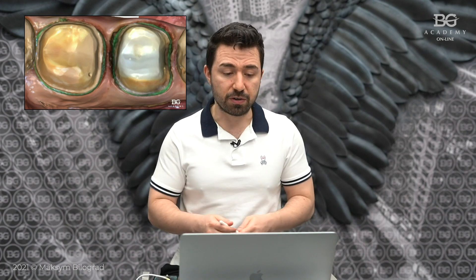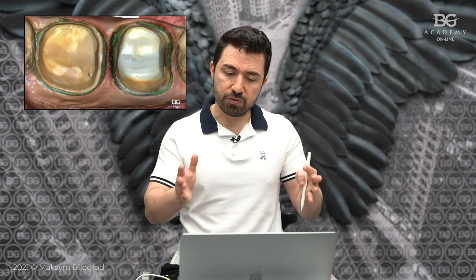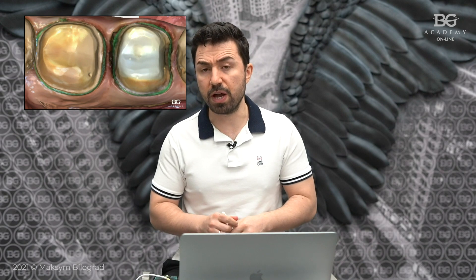The retraction cord — the green one — is very nice for intraoral scanners, by the way. The scanner I use is the Primescan by Sirona. The retraction cord, since I know you will ask in the comments, is triple zero by Shure Cord, I think from Korea. So I placed the retraction cord after electrosurgery, but there was still a little moisture inside and I was not able to scan. When you scan or take an impression, it has to be dry. So I used additive retraction — I used a retraction paste from 3M, filled all those areas with retraction paste, and kept it for a few minutes. The retraction paste gave me a very dry field and also provided a little bit of horizontal retraction.